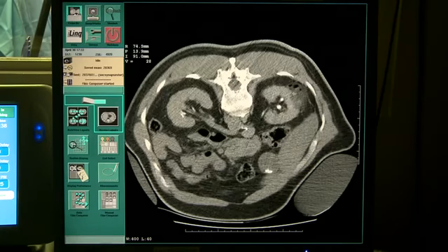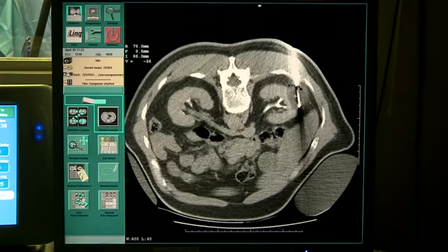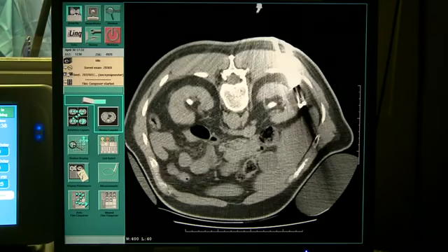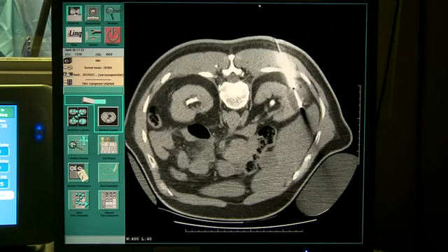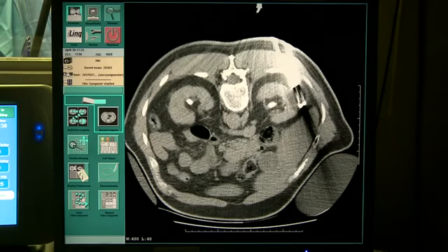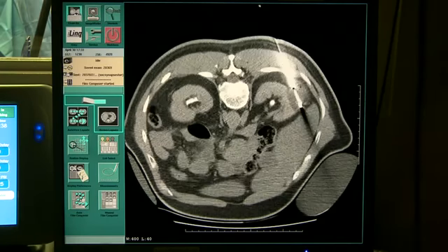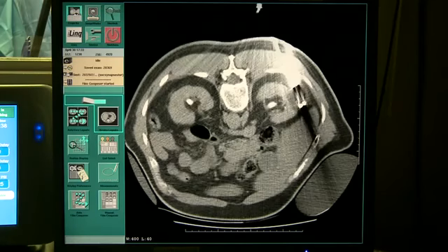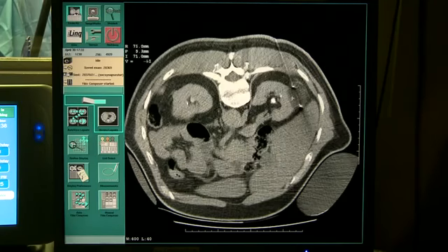And as we continue down, we're through the ice ball. A typical cycle is 10-minute freeze, 8-minute stick thaw, 10-minute freeze, but really you monitor the ice ball and you're done when you're done. I'm not beyond at all extending a freeze for 12 to 15 minutes, and I'm also not opposed to stopping it at 6 to 8 minutes.